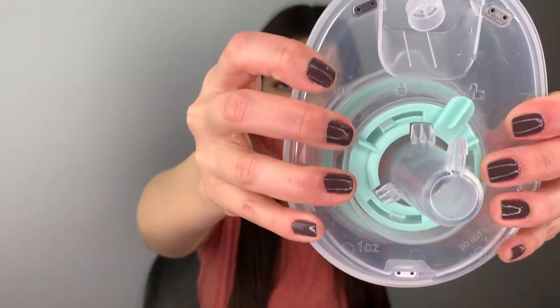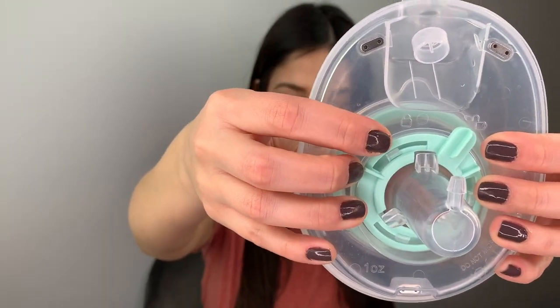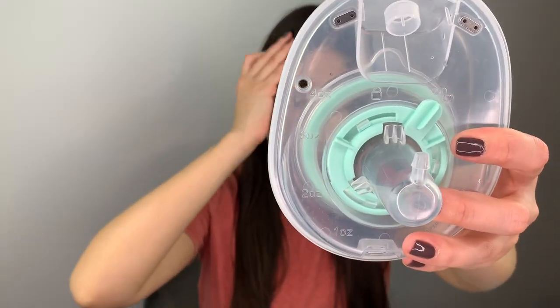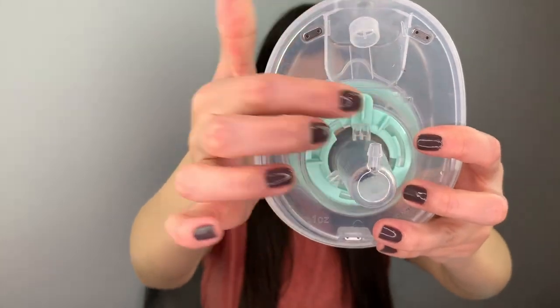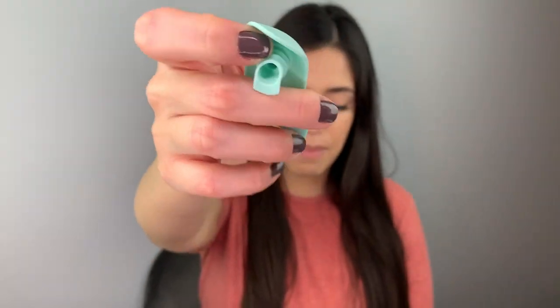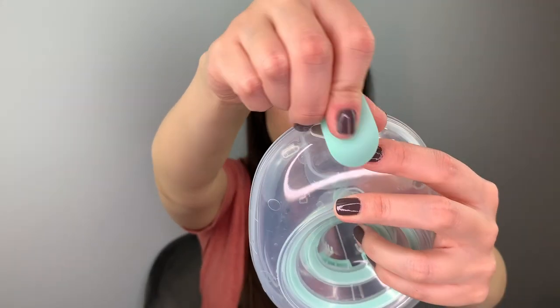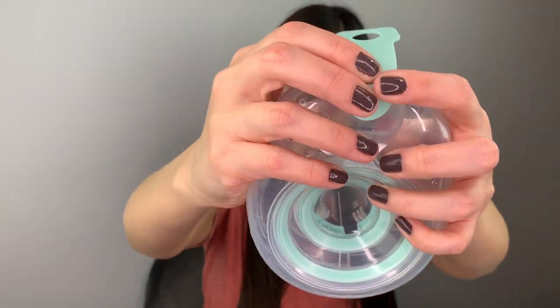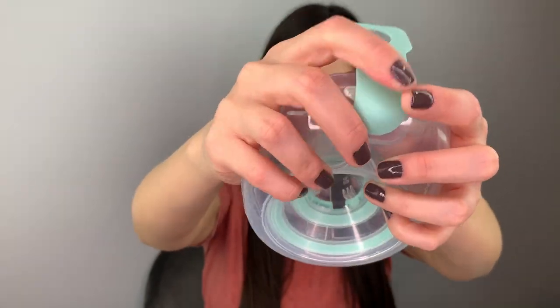In the back you'll have the unlock and lock position — right now it's unlocked. Once you've inserted the insert inside the container, you're going to lock it like this — this is the lock position. Now you're going to take the cap right here and insert this part of the cap onto the valve area like this. This is the top part.